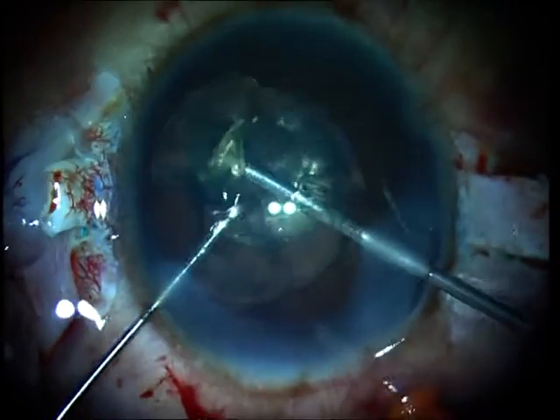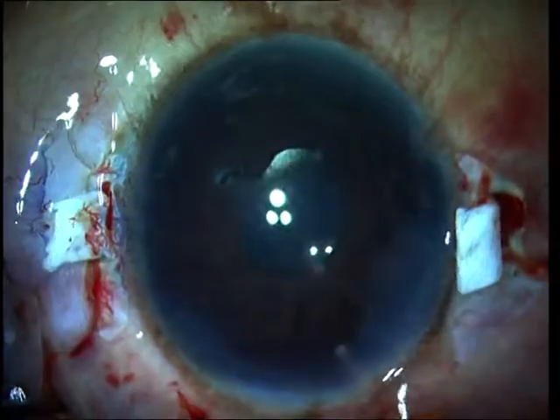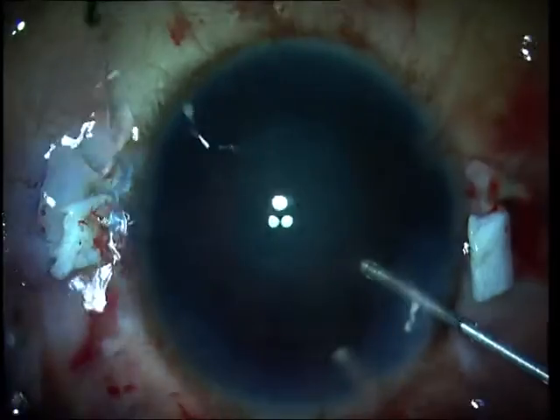This can be performed atraumatically and with relative ease since the few zonules that are left behind are also affected by the progressive zonulopathy. Lensectomy is then done with the vitrectomy probe.